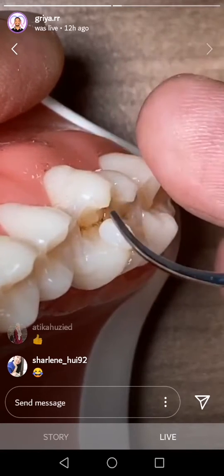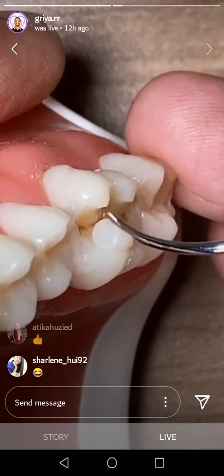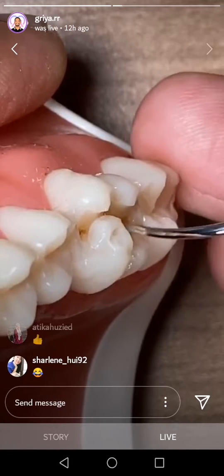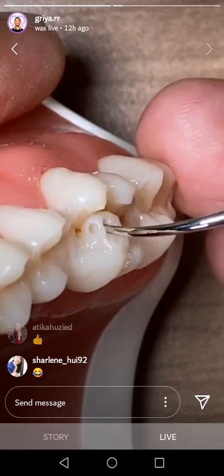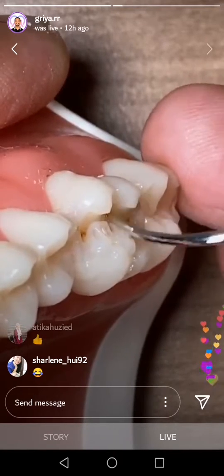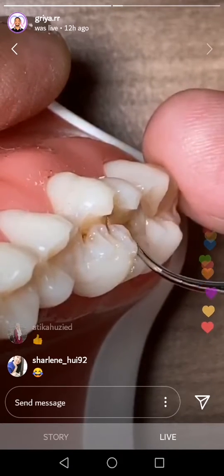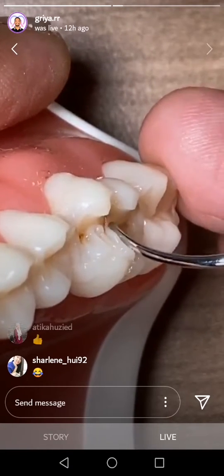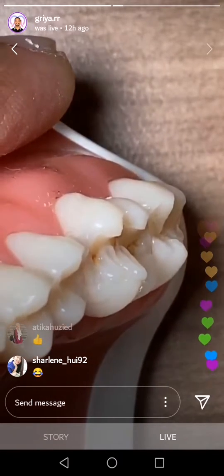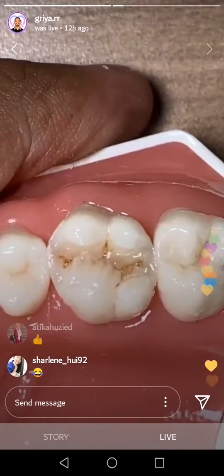That's why I love this instrument, because, see, like this. Not like this, this is wrong. This is only push. Wrong. So you need to do like this, so it follows the curve line. See, like this. This is correct. But in reality you cannot see from this side. In reality you can see from this side. Get it?